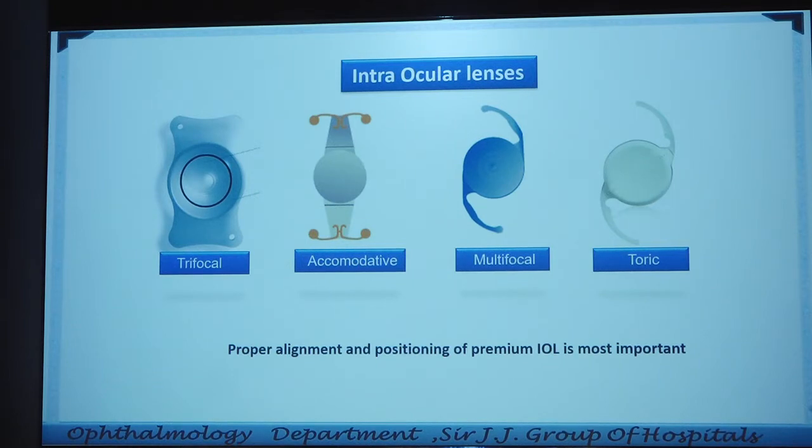It is not only for small incision surgery. See, the aims of both are different. Lens is for the vision and surgery is for the type of surgery. If you are doing phaco, the probe should pass. If you are doing SICS, the lens should come out. So different aims are there, but you can implant any lens anywhere.